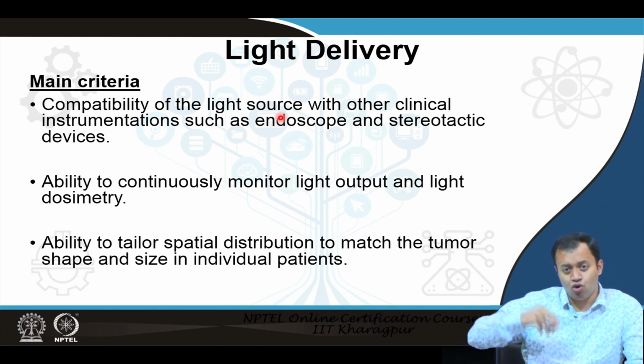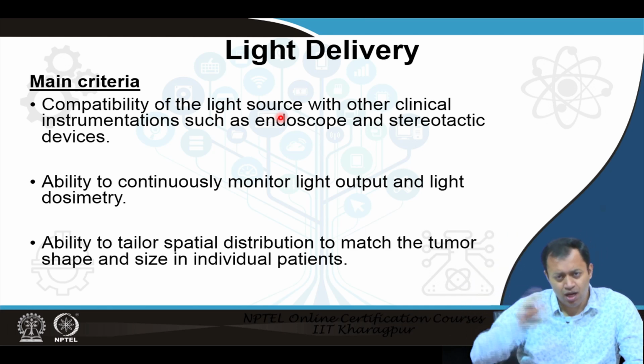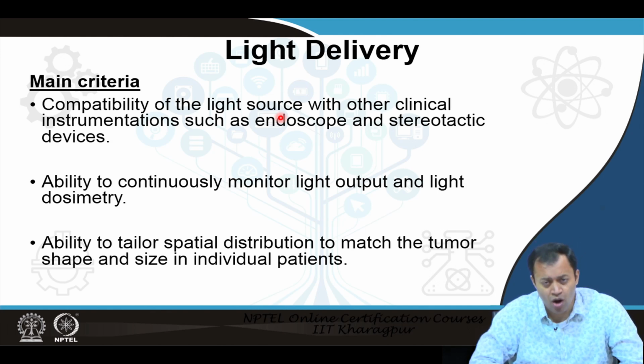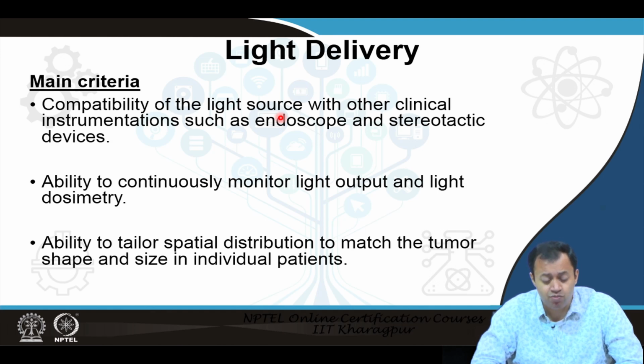We have an endoscope, an optical fiber connected with either relay lenses or these days a camera to actually monitor the tumor in real time, and how much more drug you need, how much more intensity of light you need to produce. You can actually get a good look. We can monitor the entire experiment in real time.